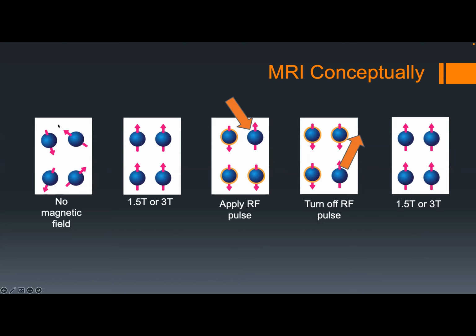MR works at the proton level. The protons in the body, or any substance that you want to image, just rotate their spins however they like. But when you apply a super strong magnetic field externally, either a 1.5T or a 3T, all of the spins want to orient relative to the field and point in the same direction. Once you put the person in, their body orients, and then you apply RF pulses externally to perturb the spins, just kind of smack them out of order, right?